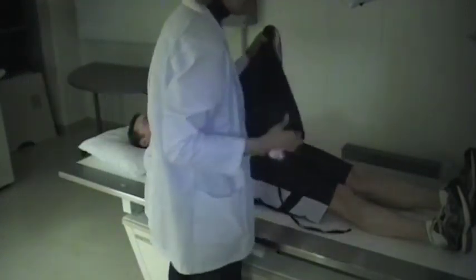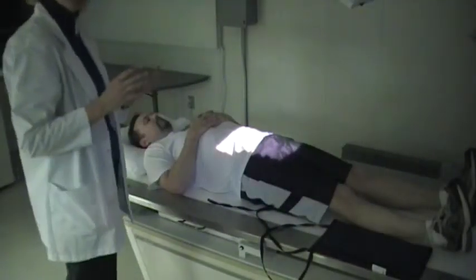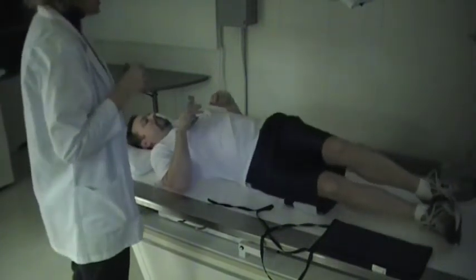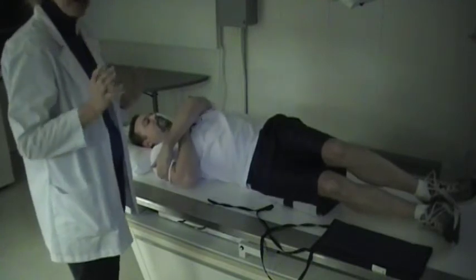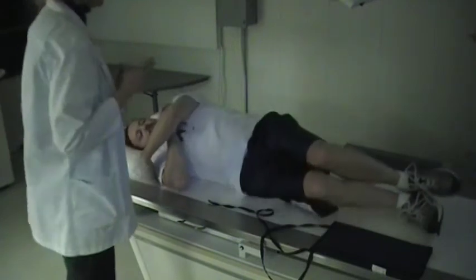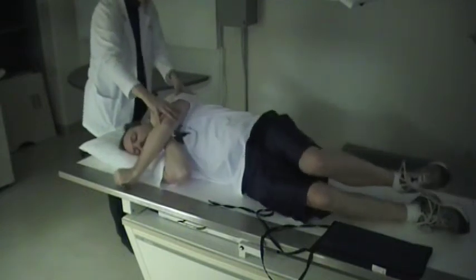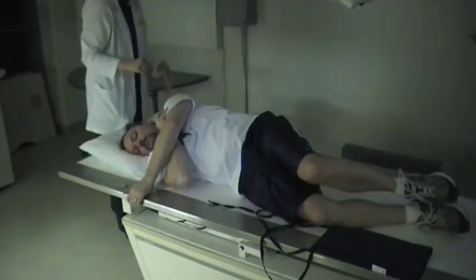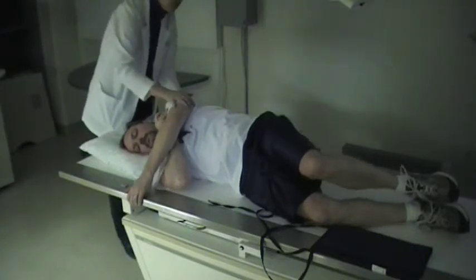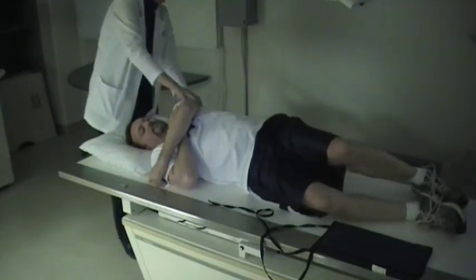For the obliques of the SI joints, you're going to have the patient oblique approximately 25 to 30 degrees. Just keep in mind, if they look like they're halfway up, that's too steep of an angle, so you always want to check that. David's turning up here — if he was halfway, when you stand here to assess the area, you can tell that's too great an angle. You're going to want to roll him back slightly to have that 25 to 30 degree angle.